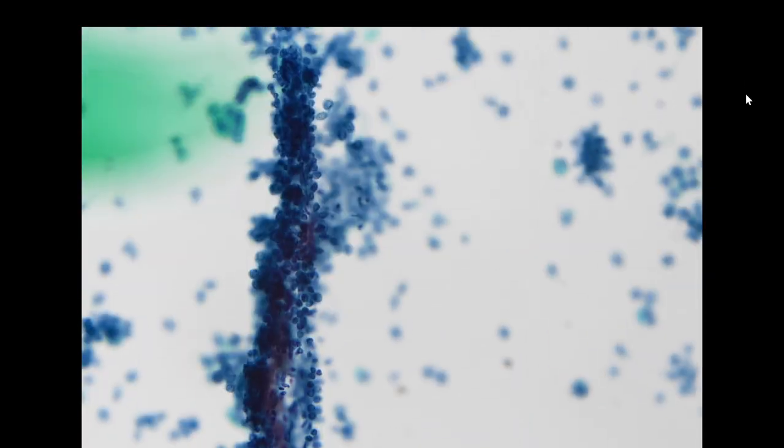On low power field, we do see clusters of cells as well as individual cells in the background. So here is a very big fragment of, where's my arrow? Yeah, it's here. So this is a very big, very three-dimensional fragment of cells. It actually looks like a papilla. It looks like a detached papilla because it has a fibrovascular core in the middle.